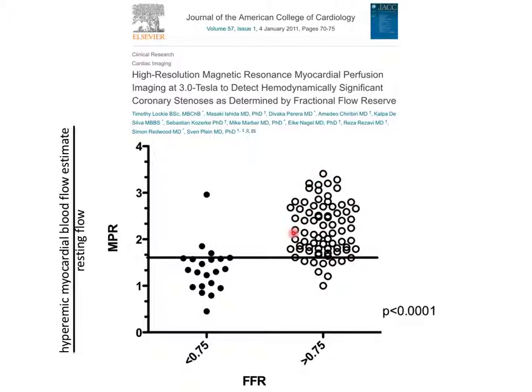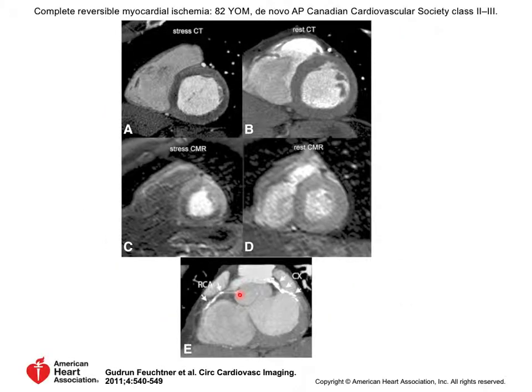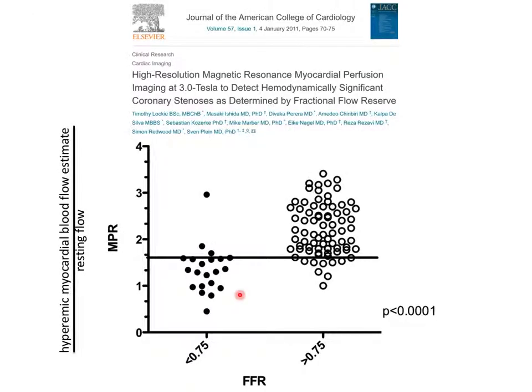Granted, there is a huge group here in which there's no question you would just say they're negative, right? So it's of value. This group in here, there's still going to be a chunk, 20% or something, that you're flipping back and forth. You don't really know. So I think it's very valuable data, but this looks a little weird to me. I don't know if it looks weird to anyone else. But okay, so that's T1-based increase in signal during contrast injection.